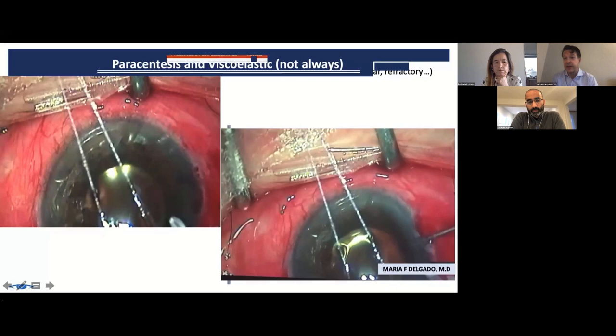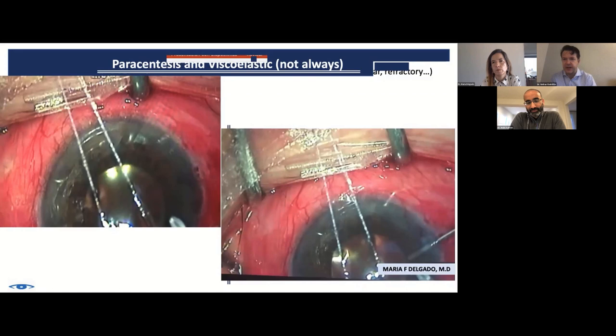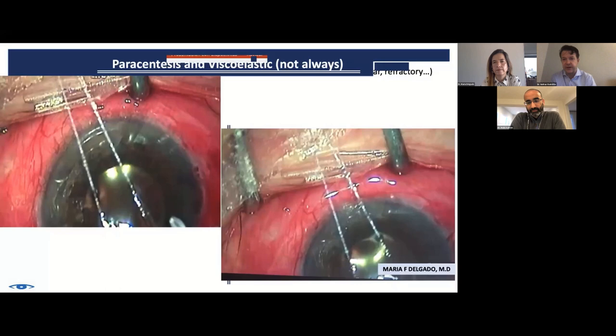I leave as much as I like in the eye. So you do not need to hedge. You can absolutely pack that eye filled with Provisc. And unless the iris gets clogged, you'll be fine. The one thing that is true is that if the iris clogs the tube and the eye has Provisc in, it will result in a very high pressure. So when you leave a lot of viscoelastic, those careful post-op day one exams are critical.